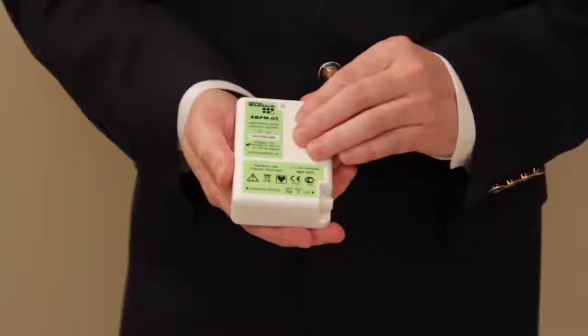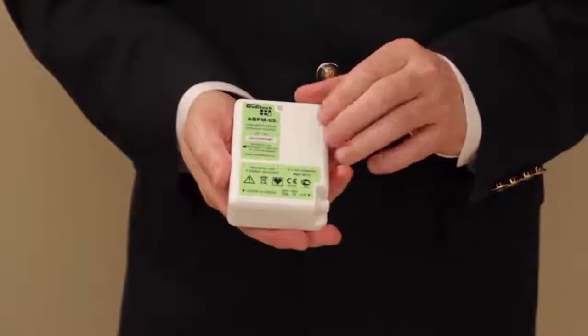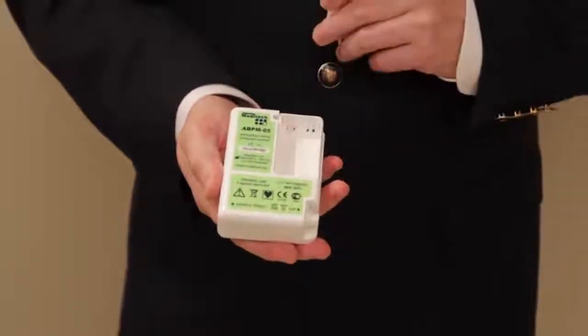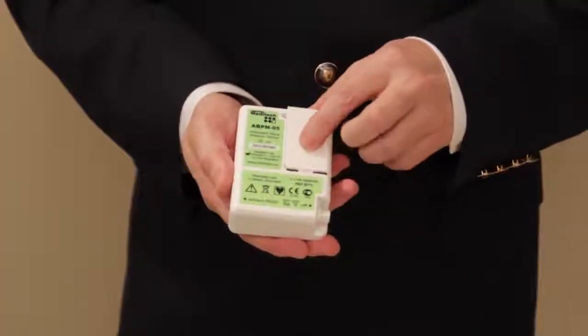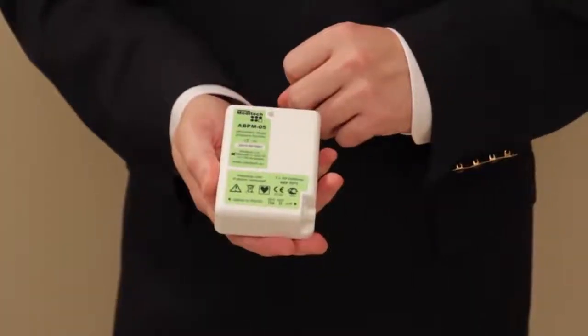The battery compartment cover is on the back side of the device. This is how to remove it. Then you insert 2 AA batteries, and after the batteries are inserted, just click it back in place.